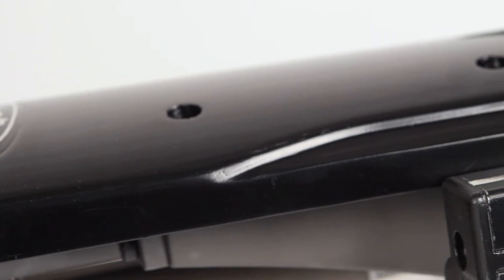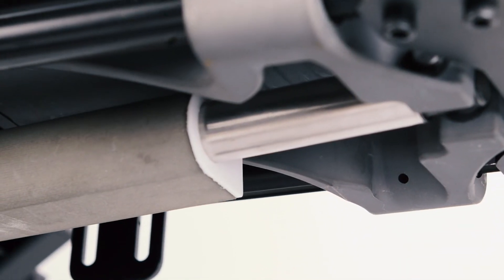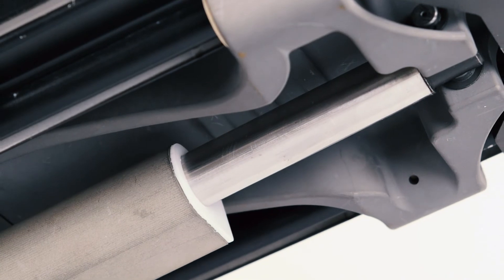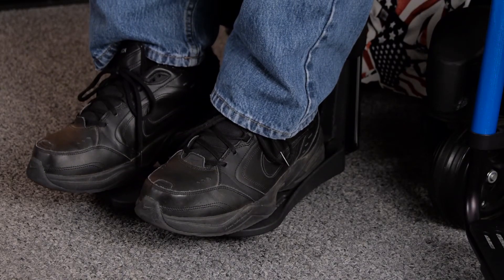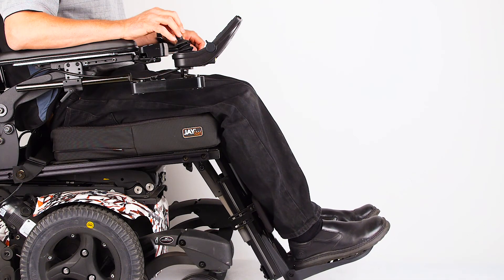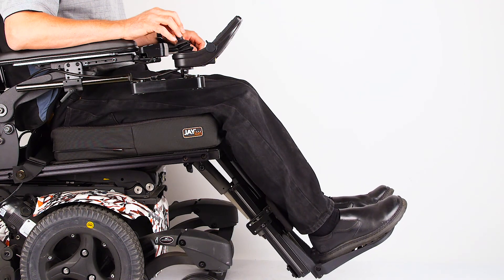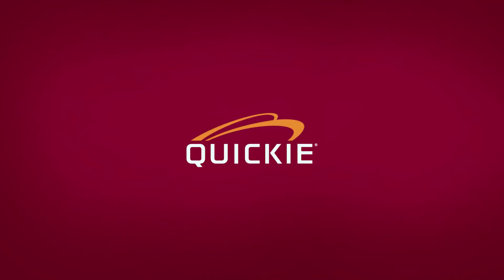In summary, the Quickie Power Center Mount Legrest offers all the traditional functionality found in most Power Center Mount Legrests, but it also offers several important features, such as independent legrest articulation and actuator-powered elevation extension, that help solve several long-standing problems found with Power Center Mount Legrest systems. Quickie — helping users live without limits.